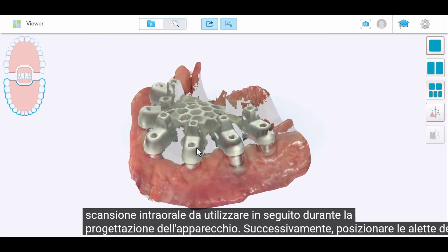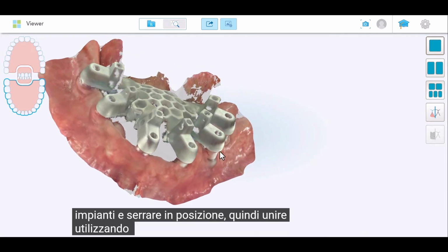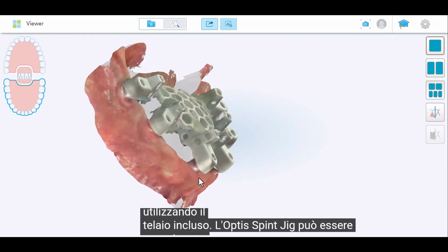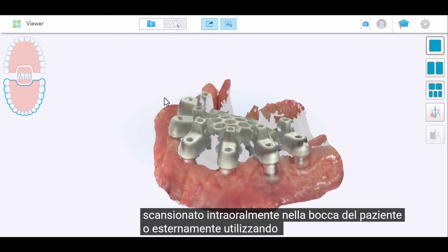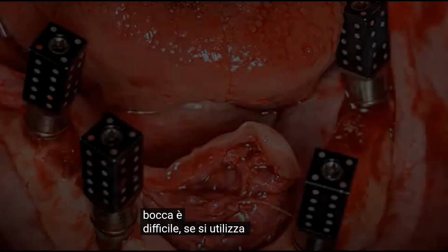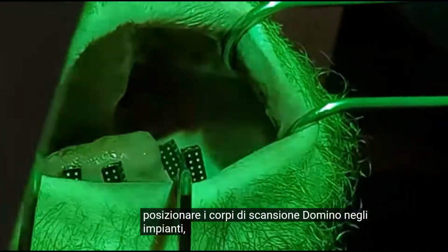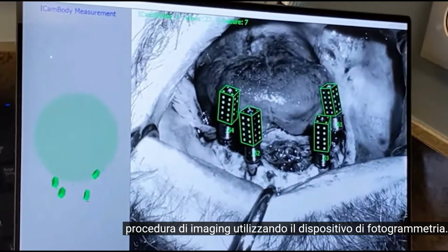Next, place the scan body wings in the implants and torque in place, then lute together using the included frame. The OptiSplint jig can either be scanned intraorally in the patient's mouth or scanned externally using the scan plate if data acquisition in the mouth is difficult. If utilizing photogrammetry, place the domino scan bodies in the implants, then perform the imaging procedure using your photogrammetry device.